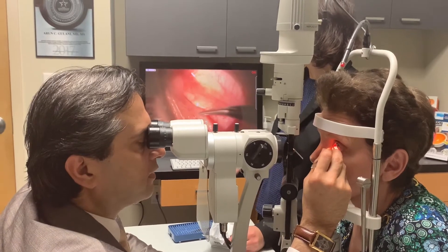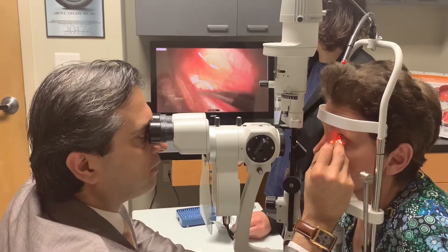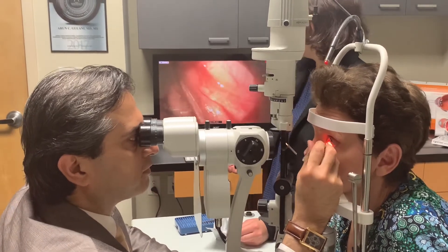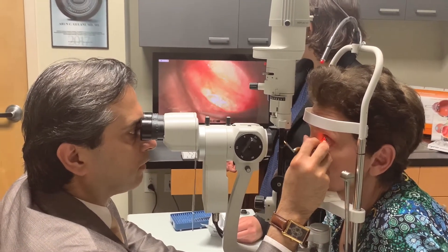That's the full insertion as you can see. We inserted it over 80% in. Then I'm following through. And then what I like to do in these cases is take one of the limbs of the forceps and walk it in.